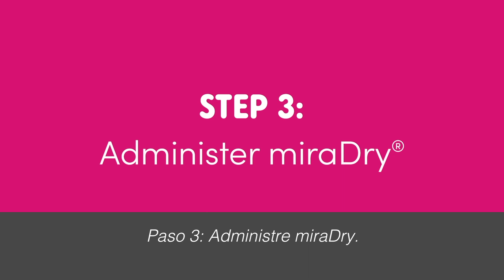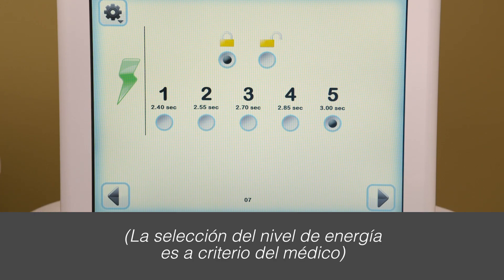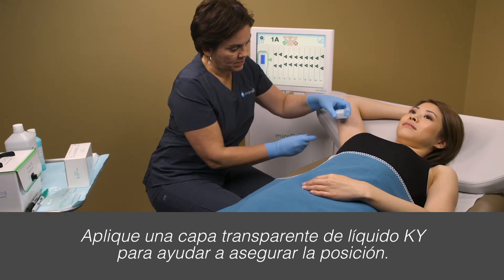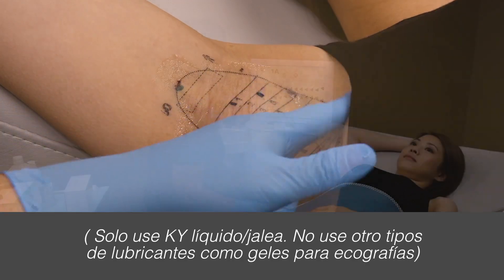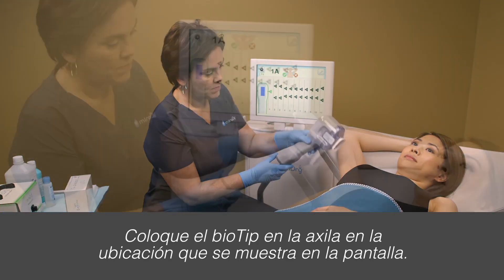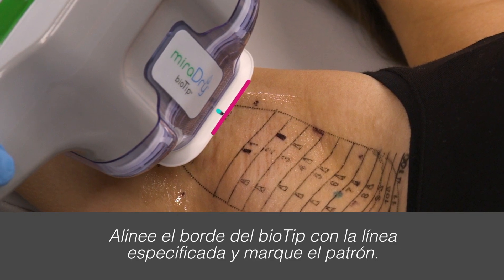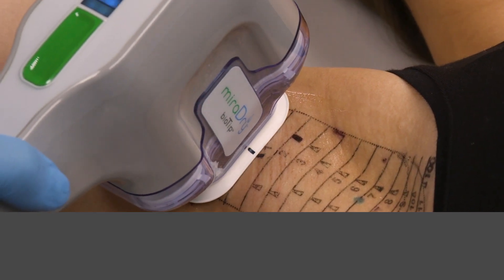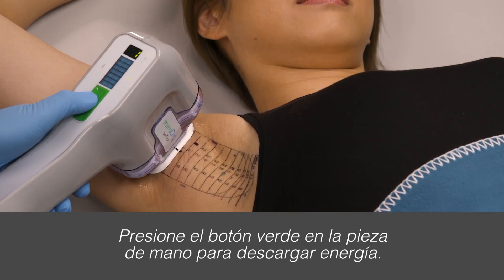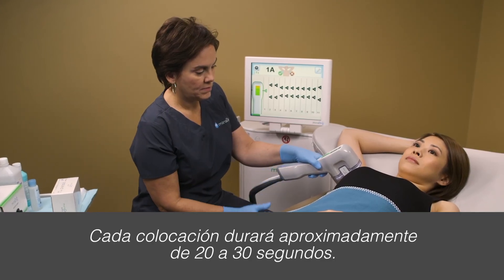Step 3: Administer Miradry. Choose the appropriate energy level. Apply a sheer layer of KY liquid to help tissue acquisition. Place the bio tip on the underarm at the location displayed on the screen. Align the edge of the bio tip with the specified line and tick mark of the pattern. Press the green button on the handpiece to deliver energy. Each placement will last approximately 20 to 30 seconds.